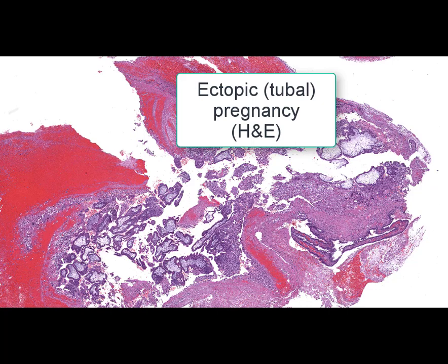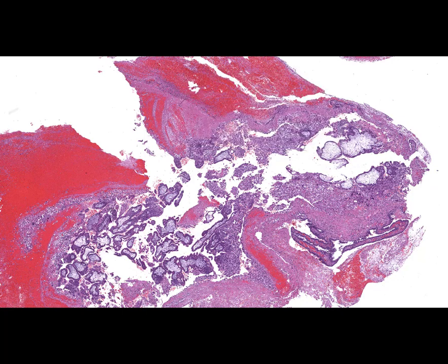On this slide we can see part of the fallopian tube, stained by hematoxylin and eosin. The name of the slide is ectopic tubal pregnancy. In ectopic pregnancy, the embryo attaches outside the uterine cavity, including in the fallopian tube, ovaries, abdominal cavity, uterine cervix, or rudimentary uterine horns.